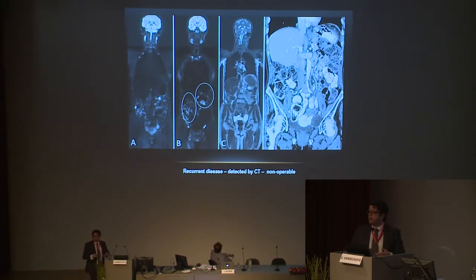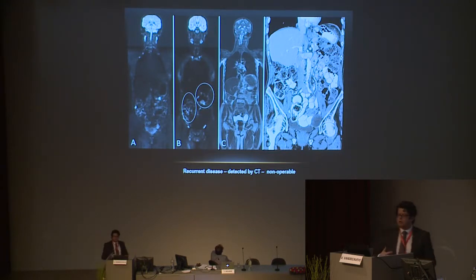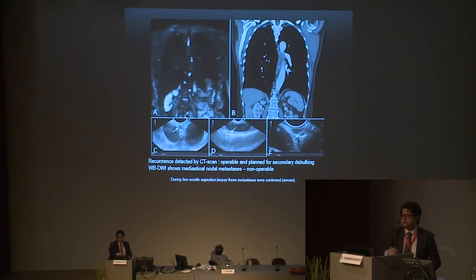But usually it is the other way around. While the CT cannot really help to guide, well, this is the typical picture of diffuse metastatic disease on the colon and the small bowel. Even on the stomach, we have here the stomach, which is filled with the pineapple juice. This is already a metastatic nodule. This is a metastatic nodule. But look, semi-cystic solid deposits. This is the wall of the stomach. All these small nodules on the wall of the stomach, ascending colon, and also here on the terminal ileum. So actually it's a diffuse visceral carcinomatosis in this patient.